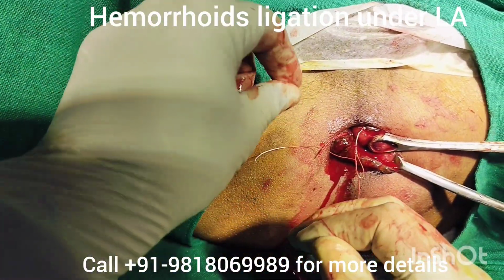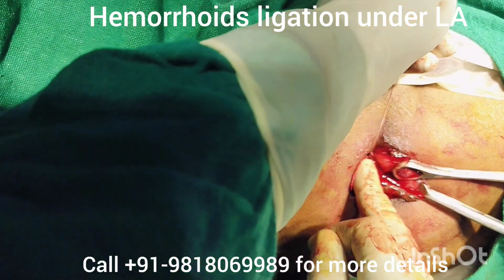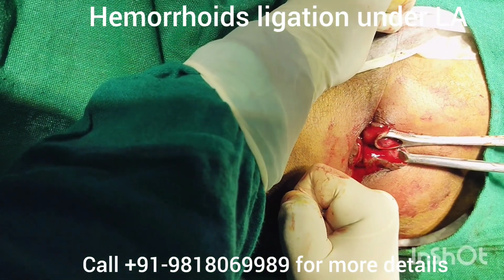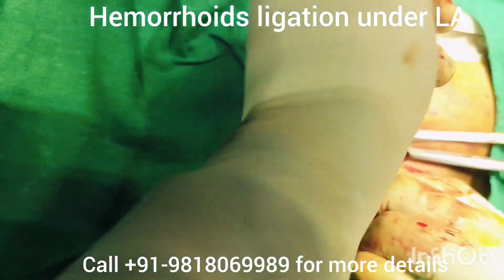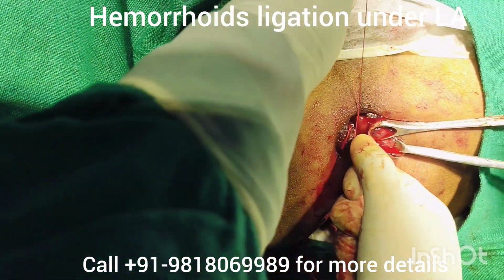This first knot is medial. Securing this knot.